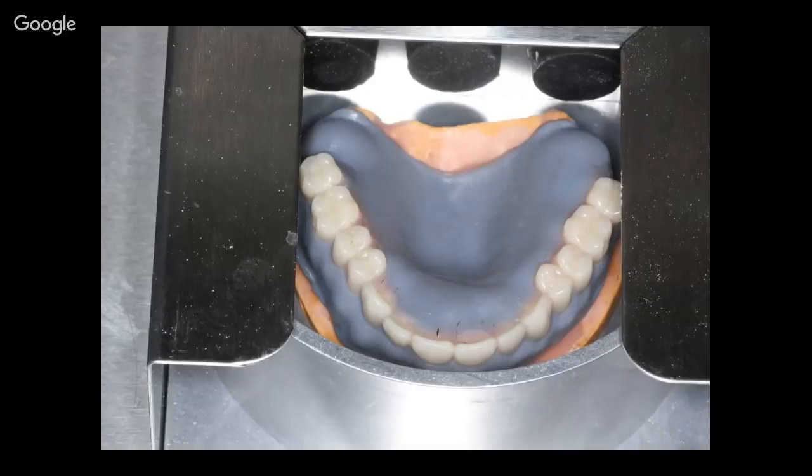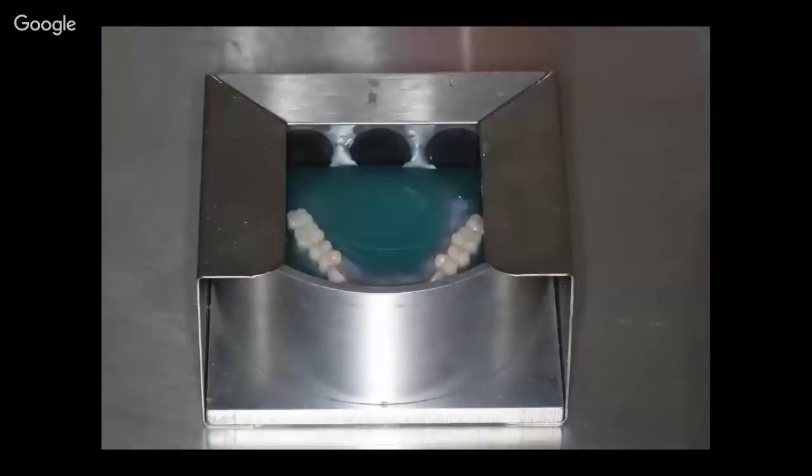Okay, so I've put the sealed up model down into the Frick flask. And now what we'll do is begin using the reversible hydrocolloid. So this is some stuff that you just heat it up to its melting point, and it's like a liquid that you would pour in, and it captures detail very, very well. Again, I'm a redneck, and I fully admit to it. I went and bought a little crock pot at Walmart. So this was a $20 crock pot. That's what I heat up my reversible hydrocolloid with. Works great. And then I can pour that off into the flask.